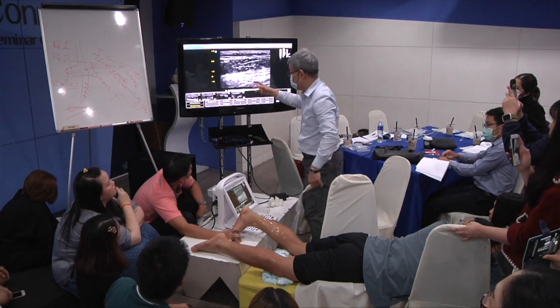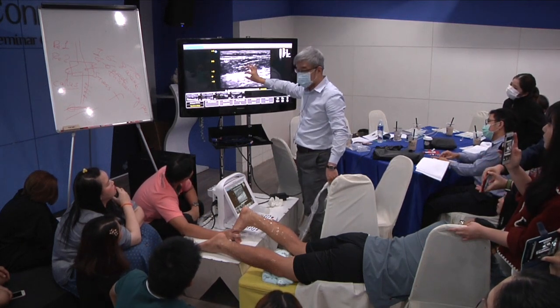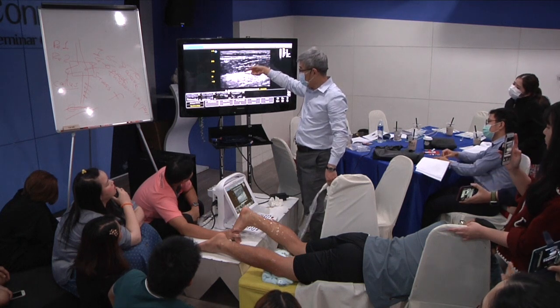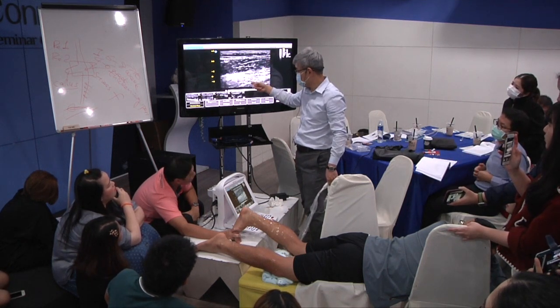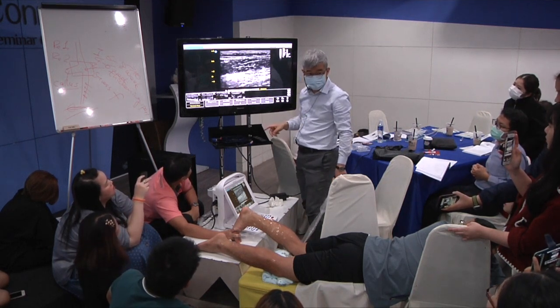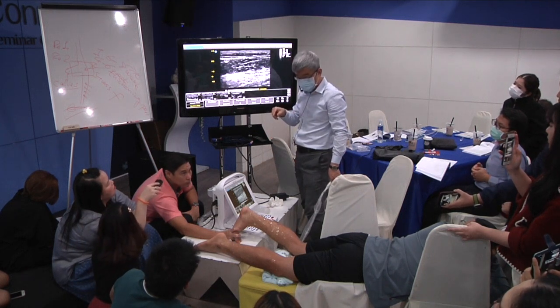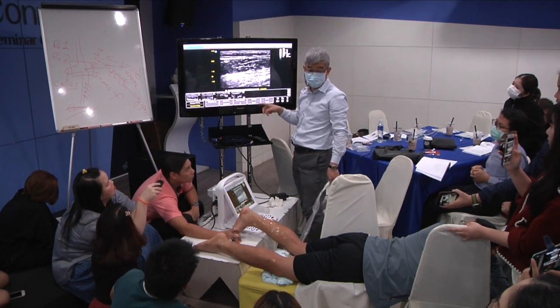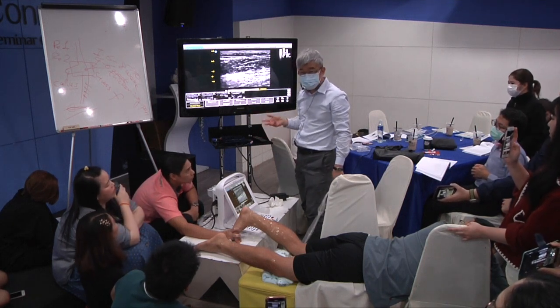If you find a very bright tendon-like structure below the medial gastrocnemius, the end of the medial gastrocnemius, and the soleus, plantaris. Yes, plantaris. Thank you very much. Good, it's your job.